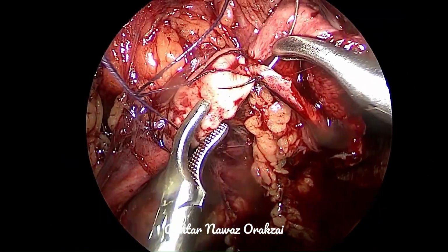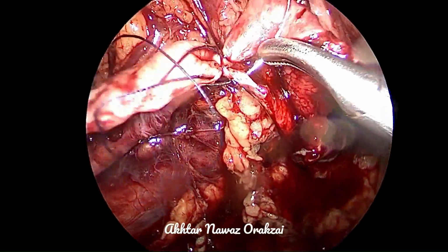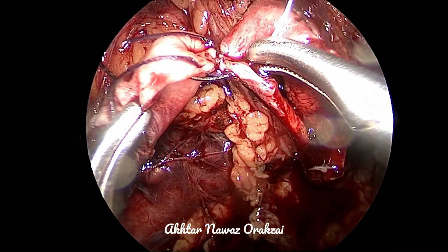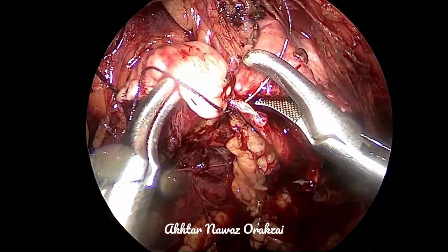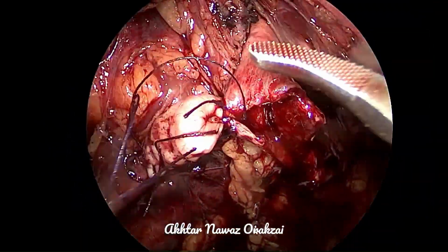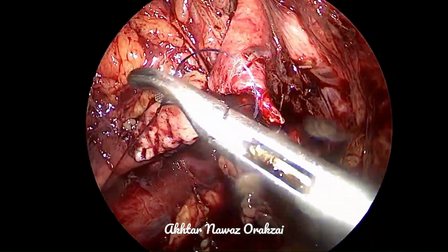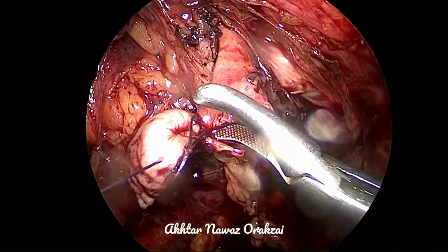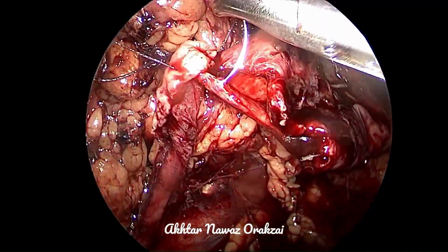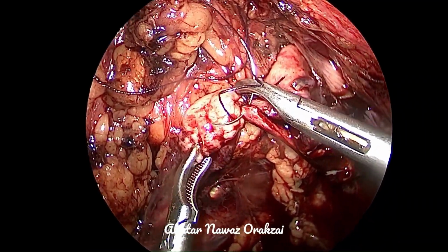So talking about the free drainage, preferably nowadays the DJ stent is the method of choice to provide free drainage. So there are advantages with the DJ stent. Number one, it is an internal diversion and the patient does not have to carry any bags externally. Number two, it is bridging the anastomotic area.